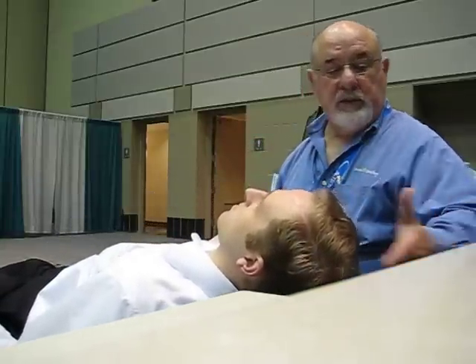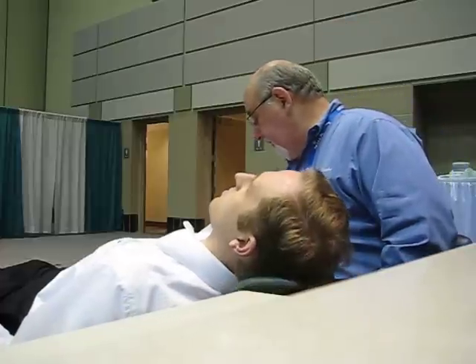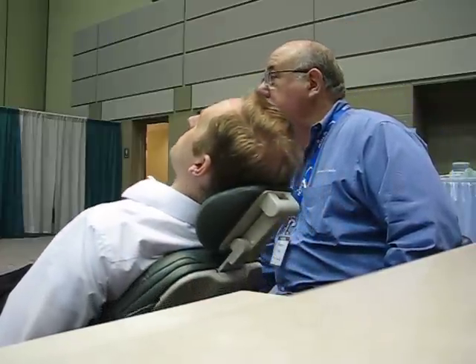So, as you can see here, we don't have 24 inches. Right, we're tight. So what happens here is, first of all, this chair has 5 programmable positions plus an exit. What I'm going to do, I have a program with me unless somebody tampered with it, which has been happening. This is what I call the greeter position.